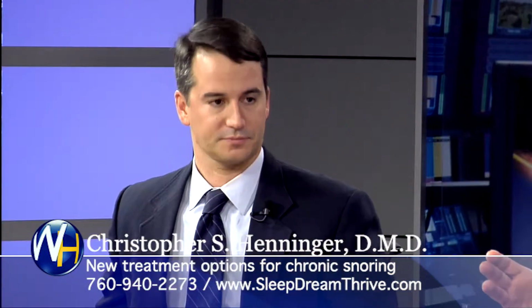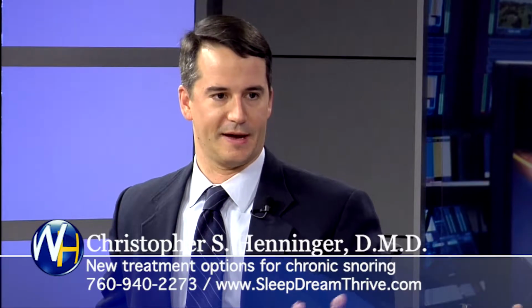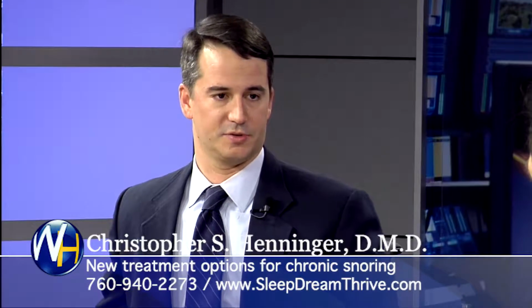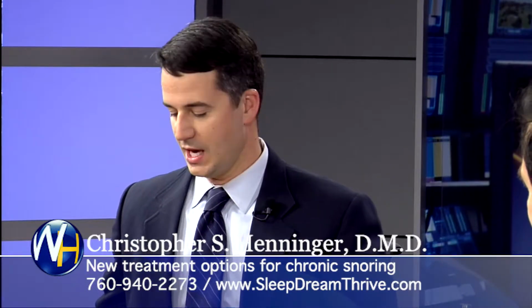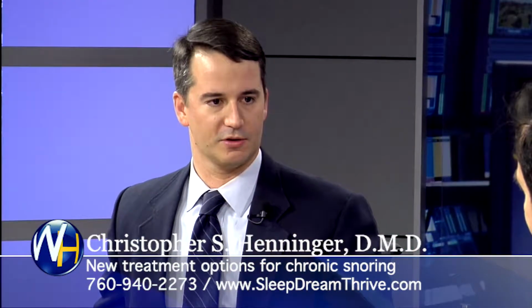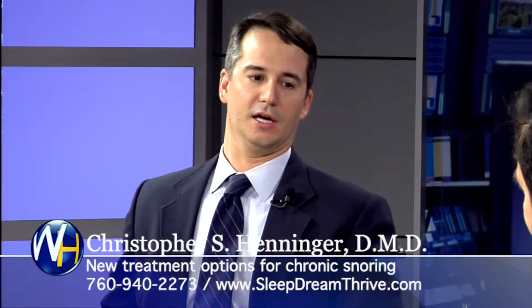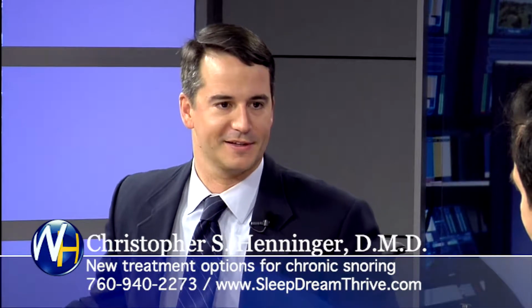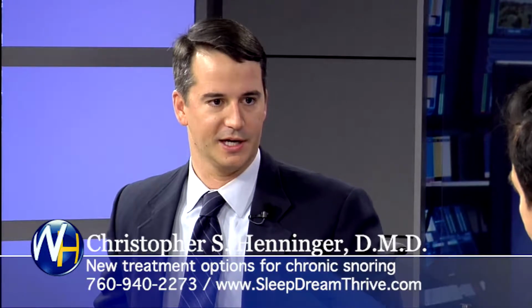So when you open up the airway, for some people their snoring goes away? Exactly, Randy. The snoring is the vibration of your soft palate in the back of your throat when you're trying to breathe, so it's obstructing your ability to breathe. And when you bring your lower jaw forward, it brings all that tissue out of the back of your throat and eliminates snoring, which is a huge advantage for somebody whose wife has kicked him out of the bedroom because of his loud snoring. You say that happens a lot.